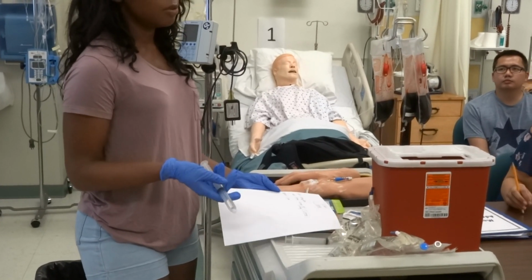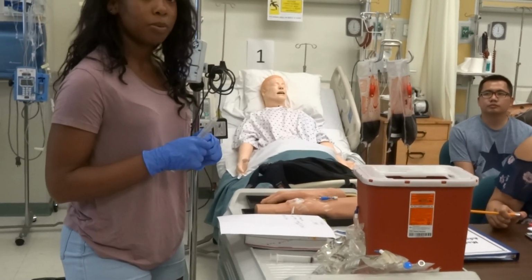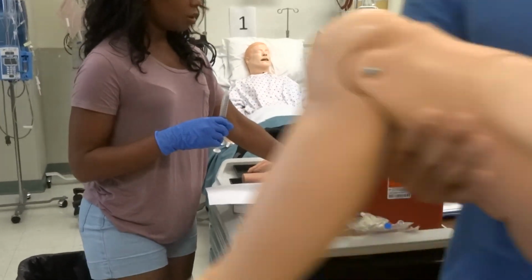Okay, so what do you take from the med room for an IV push med? Flush. Okay, normal saline. Syringe. Your medication.